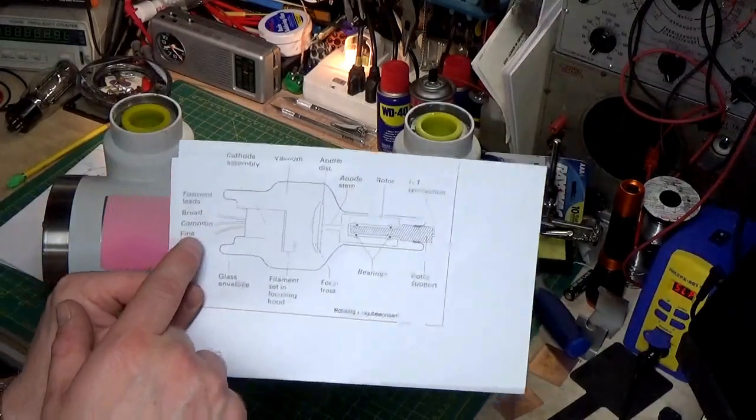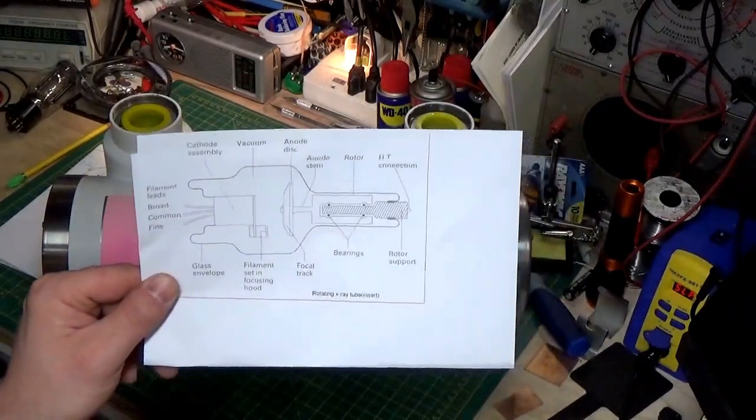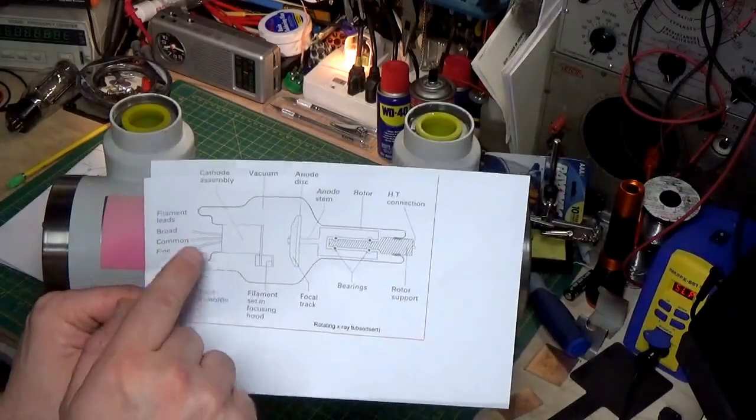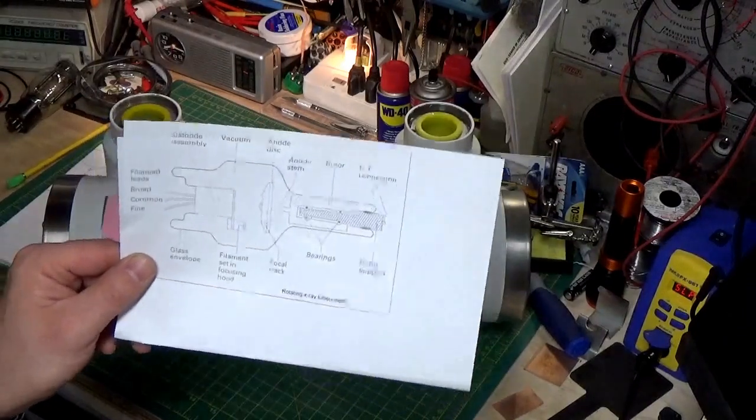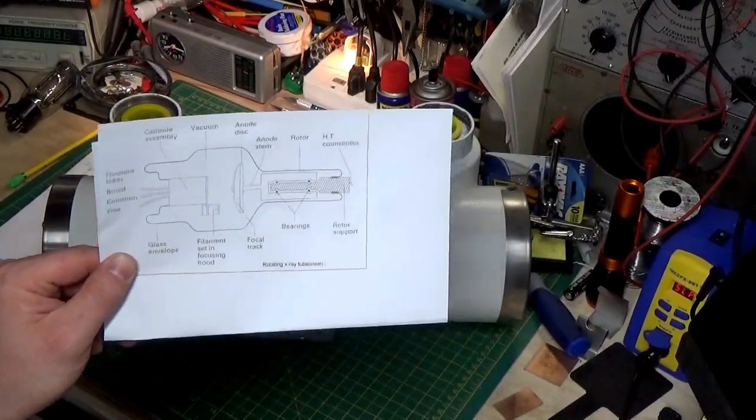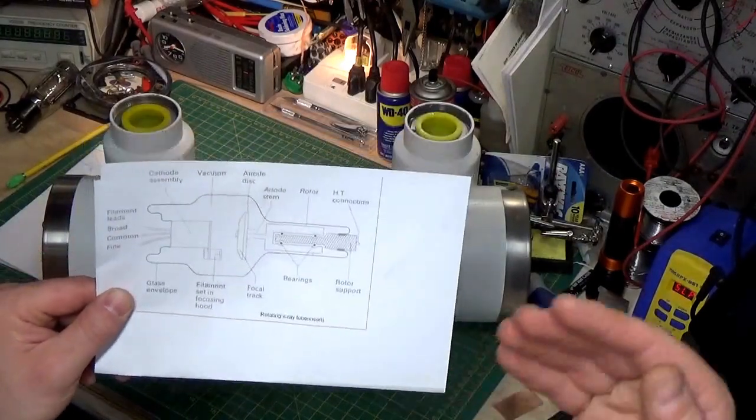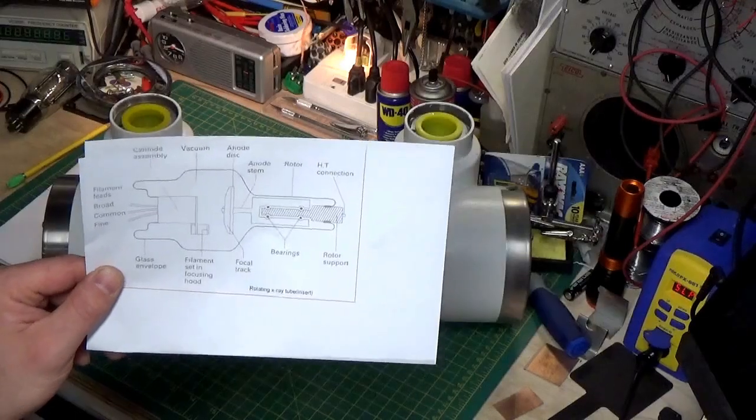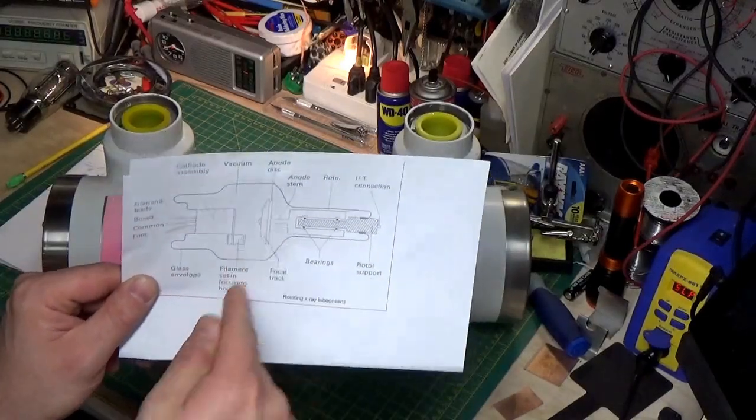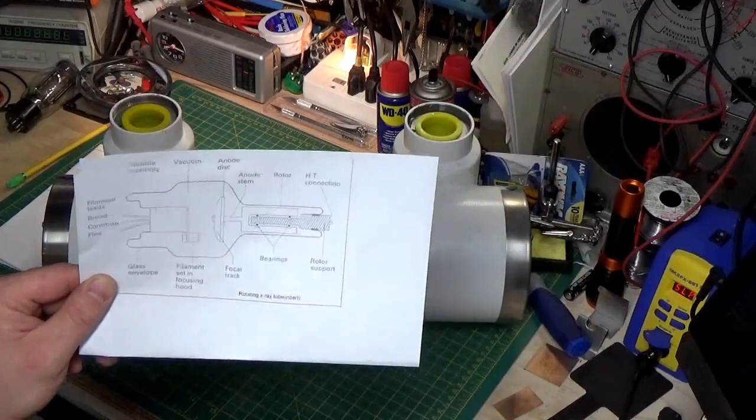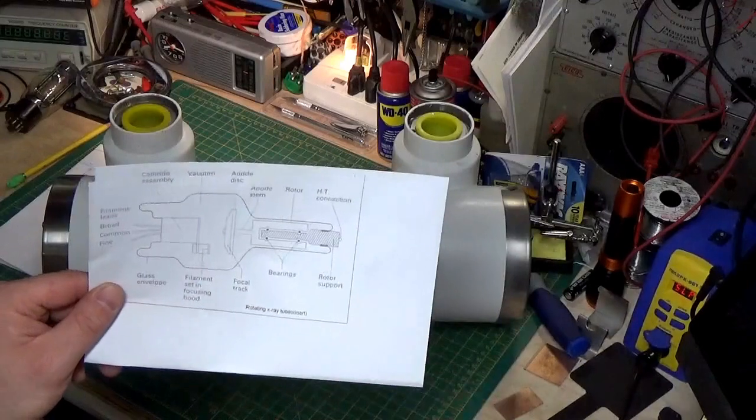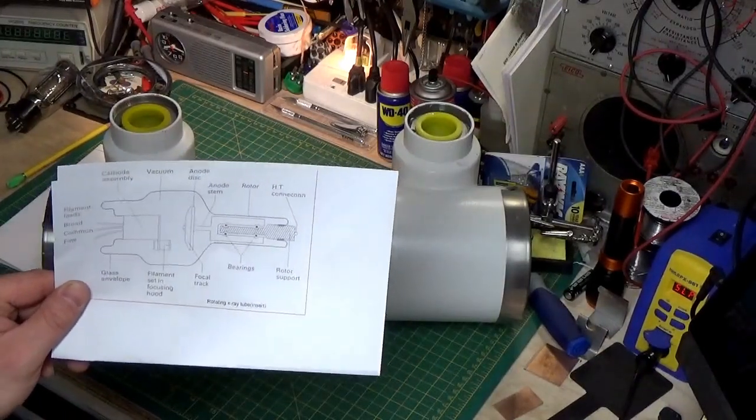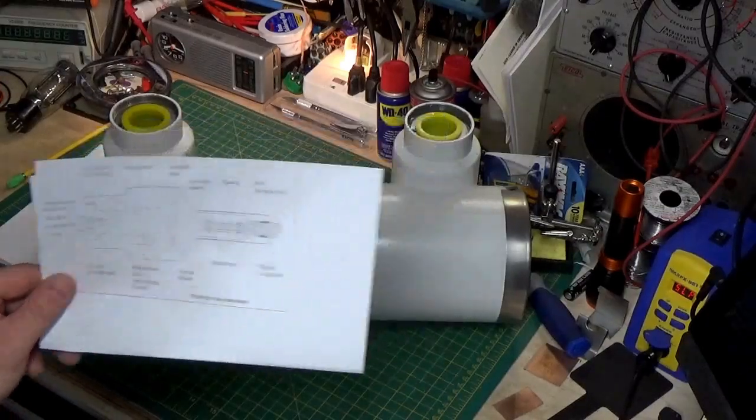And if you look here, these are the three leads that go to your filament. Now, you might say, why are there three? Well, there's a large filament and a small filament. And I'm not really going to get into why we have two different filaments. But it has to do with the larger filament can handle more energy. The smaller filament handles less energy. However, the small filament can make a finer beam. The larger filament makes a coarser beam. So, if you want to look at great detail, you use the small filament. If you want to penetrate a larger object, you use the big filament.